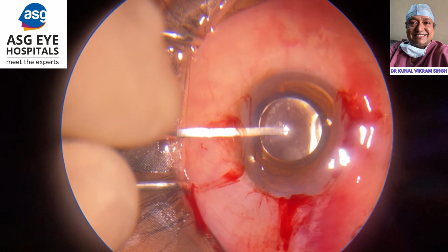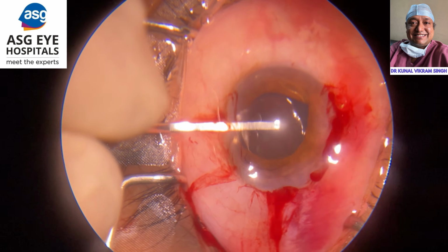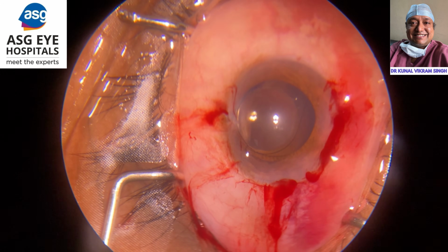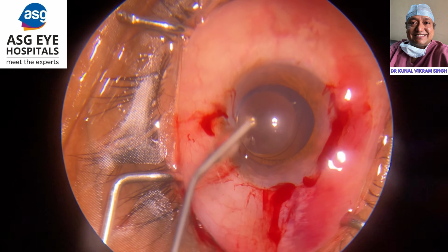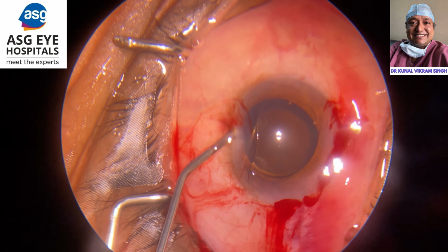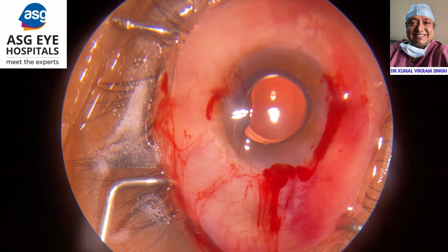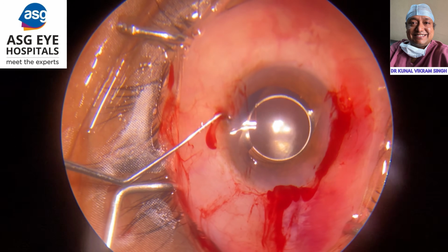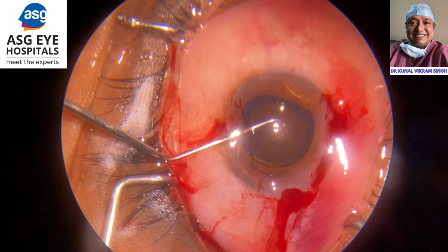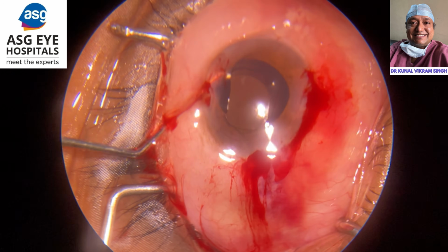As you can see, the IOL was not ready to go inside the bag because the bag was really ballooned up. So now I thought that what would be required in this particular case is anterior vitrectomy, because unless I relieve the anterior vitreous of any trapped fluid, this AC will not form, and that can lead to a lot of problems like endothelial damage and iris damage. And this was a single eye case, so I had only few options left.